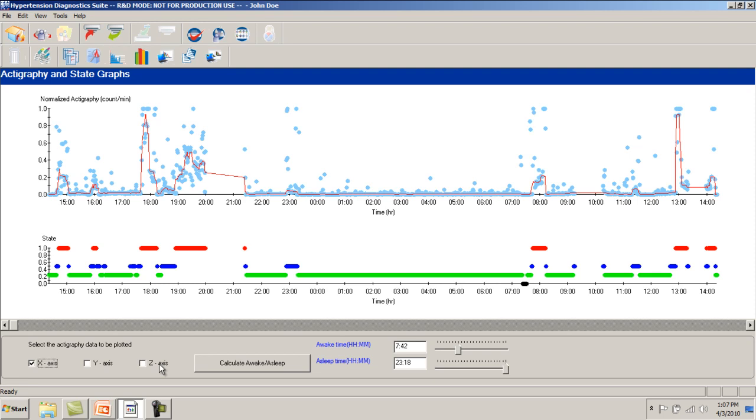During active states, such as walking, the color displayed is red. For restful activities, such as sitting or relaxing, the display color is blue. For non-active periods, such as sleep, the display color is green. If no data has been collected during a particular period, the color displayed is black.